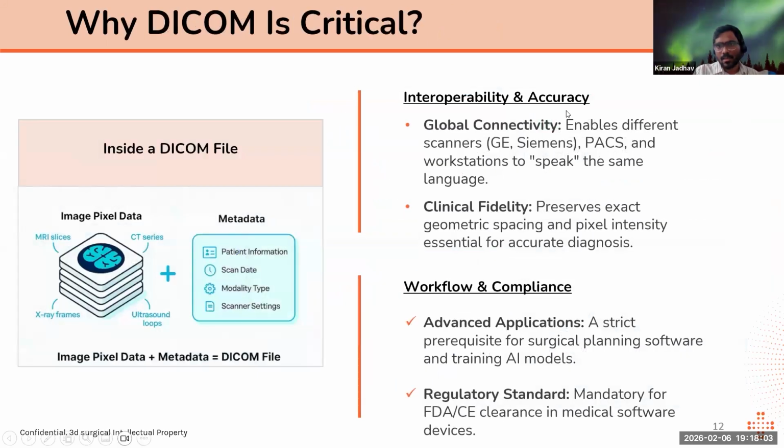As I discussed, other machines will also have the same DICOM tag information, so they can speak the same language. And why are DICOM images preferred? We can have this particular data with radiological data. Also, it preserves the geometrical spacing and pixel intensity in a proper manner. If we talk about other images, which are non-medical, they will not have this information. They will have the pixels, but will not have control over the geometrical spacing or pixel intensity.